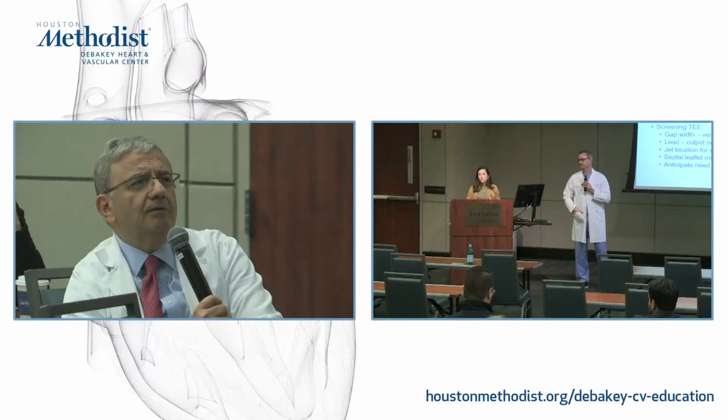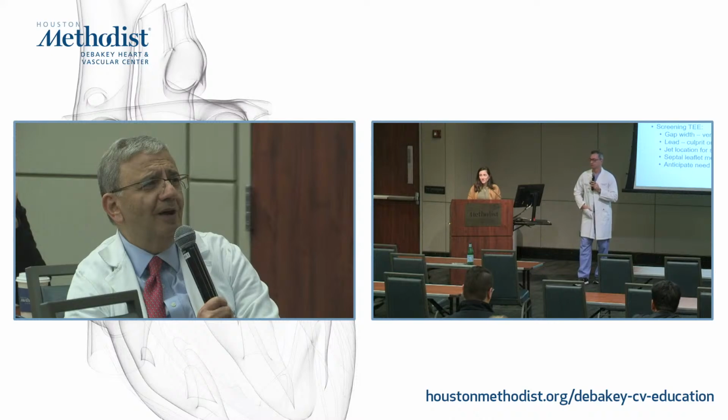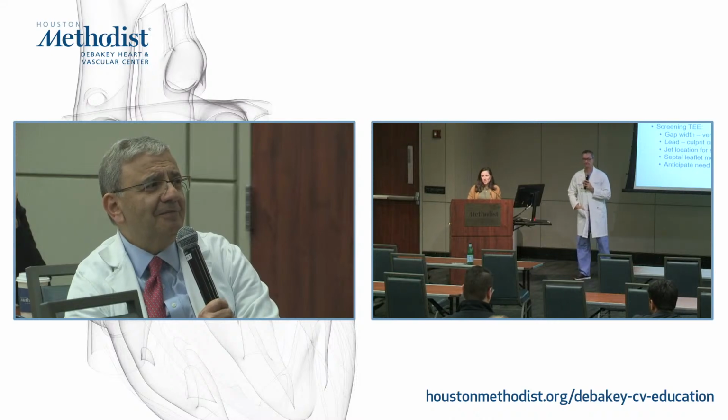Who decides on the size of the clip? The short, the wide, the long? That's a great question. At least in our institution, which is something that I'm very proud of, it's a shared decision. So we discuss with our interventionalists before they walk in. We screen the patient before, and we screen the patient again when the patient comes in and is fully under anesthesia.